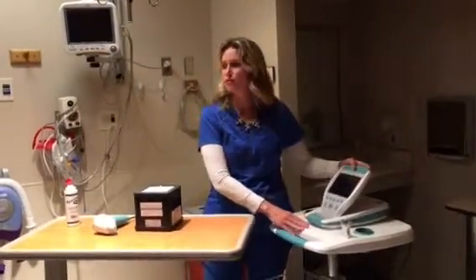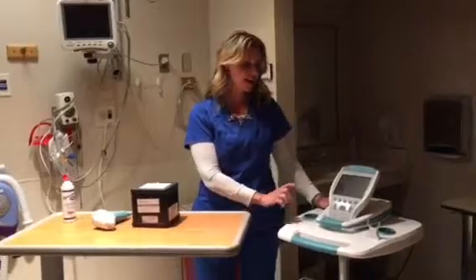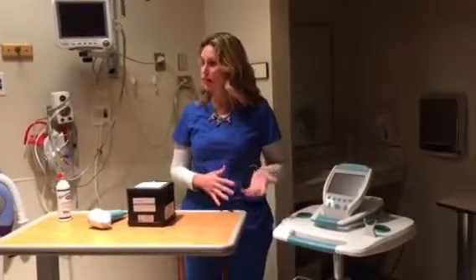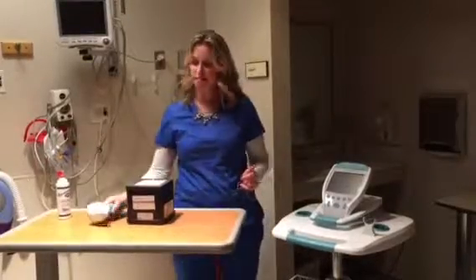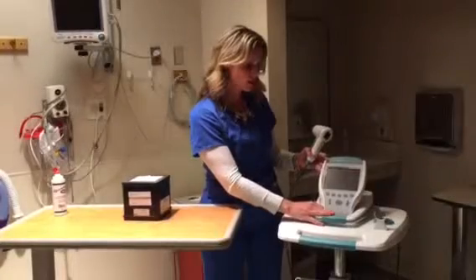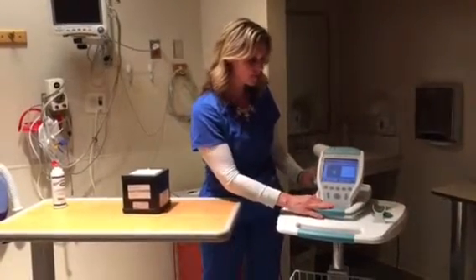Today we're going to have an in-service of the bladder scan. This is a BVI 9400. You are used to a BVI 3000. Same manufacturer, just some different bells and whistles on this machine. The first thing that you do is turn on the machine with the universal power button here.